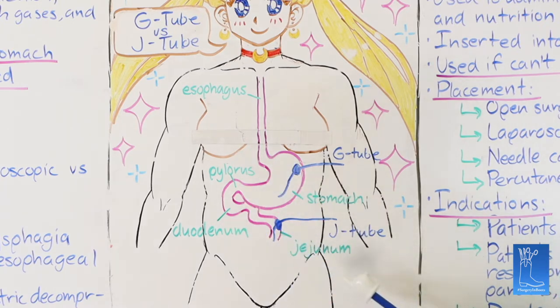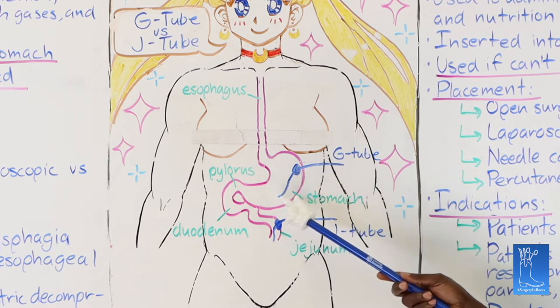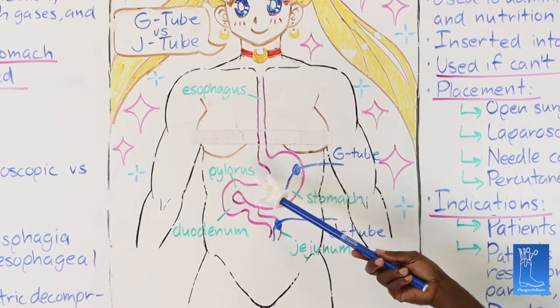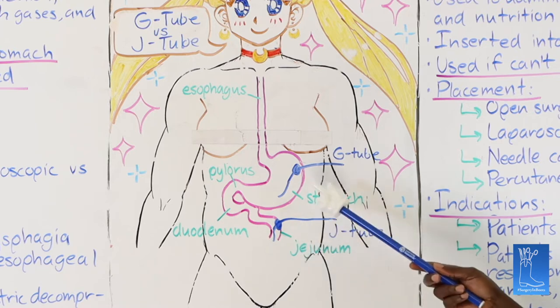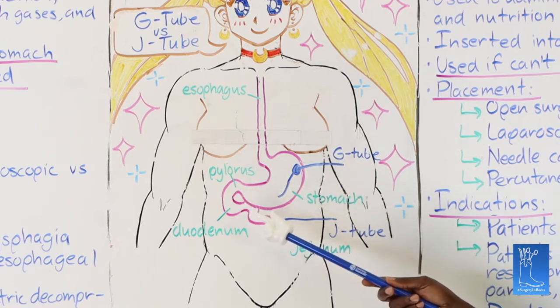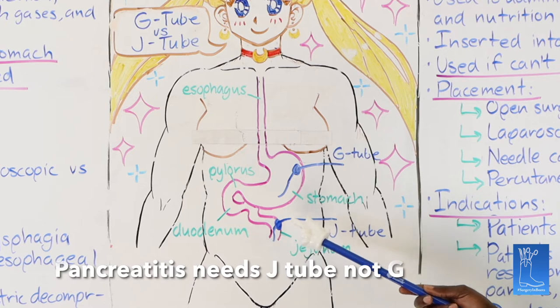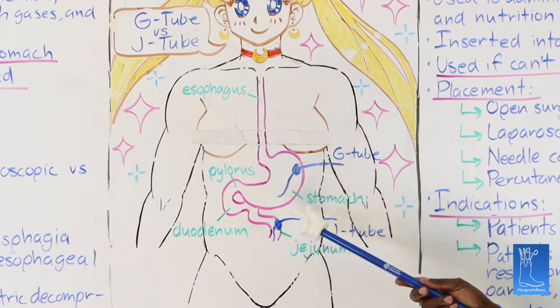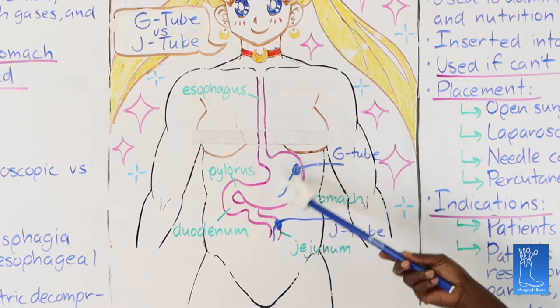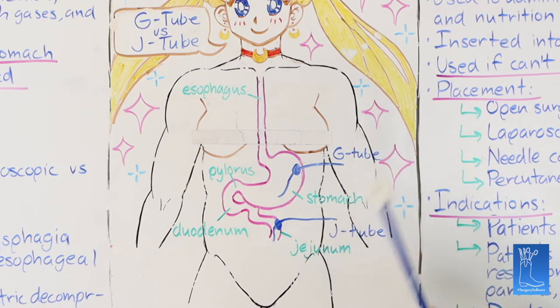Now, that has a couple differences. One, the stomach is big, the jejunum is small. Even if you eat a big meal, your pylorus decides how much should go out at each time. So there's a time release versus the jejunum, where there is no time release. The G-tube can stimulate your pancreas versus the J-tube, if you put it down far enough, it does not stimulate your pancreas. So one small difference is chronic pancreatitis patients typically have J-tubes and not G-tubes for this reason. So it's really the structural difference between the stomach and the jejunum and the placement of the tube as to why we use one versus the other.